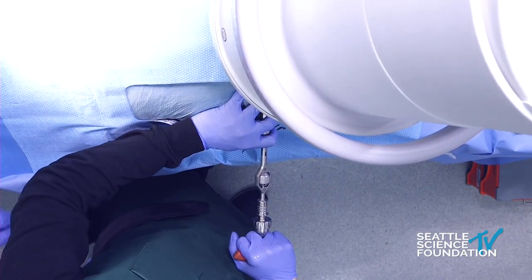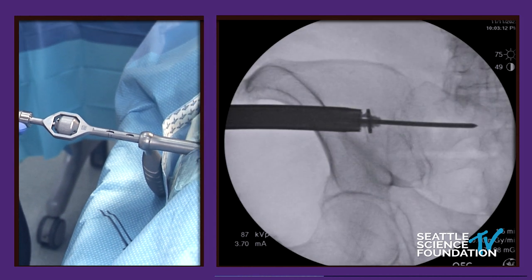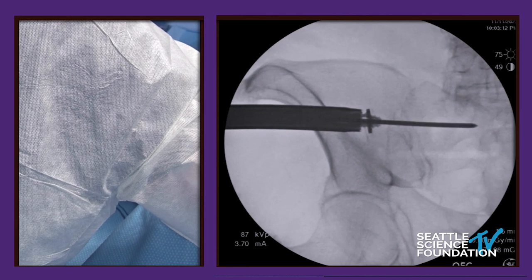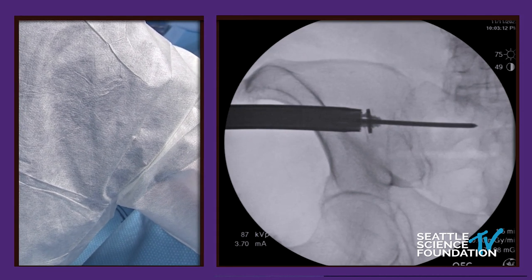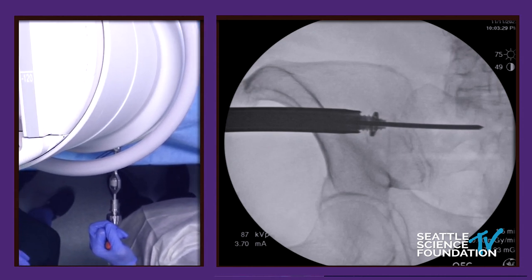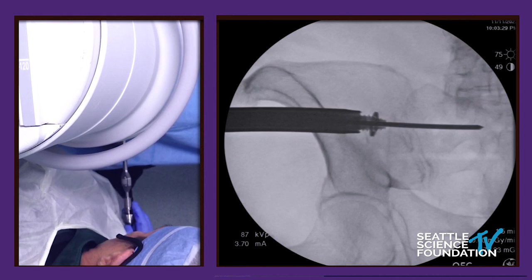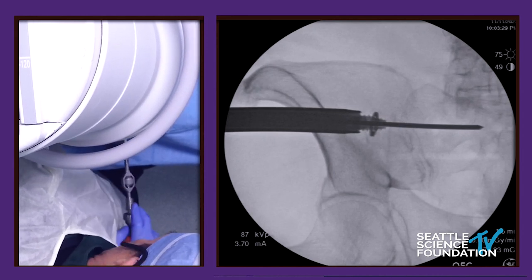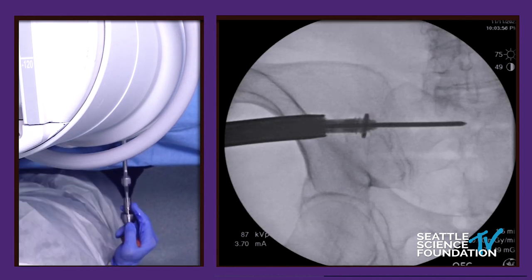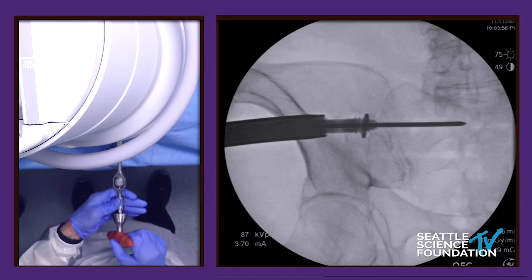Come back to the outlet view. We're going to bring it right up to the SI joint — it's going to get a lot tighter right up to the SI joint. We're advancing the screw there. Unfortunately, that's not going to work because of the ring obstruction, so we'll come out with this and go down to S2 where there is no ring.